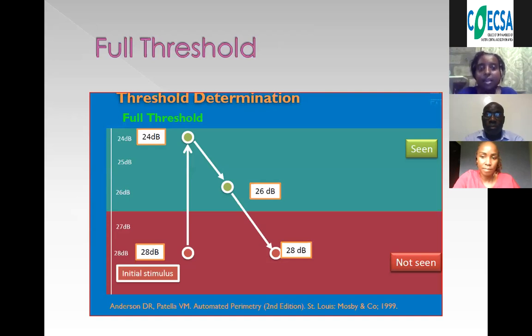And then they made it a bit more dim, and dimmed it again until the patient could not see. It's called a double staircase strategy, or bracketing twice: from unseen, to seen, then back to unseen.